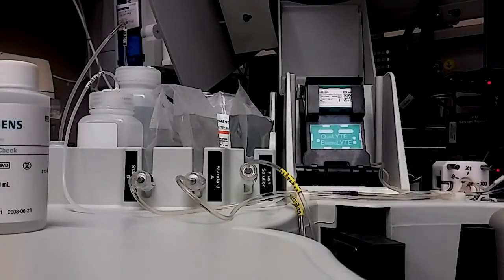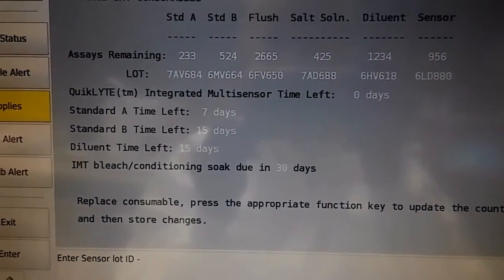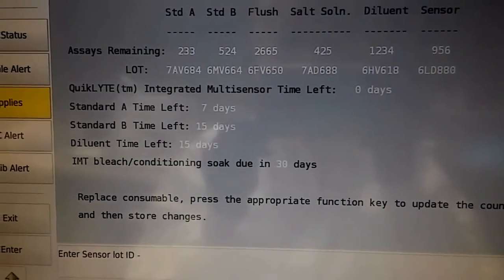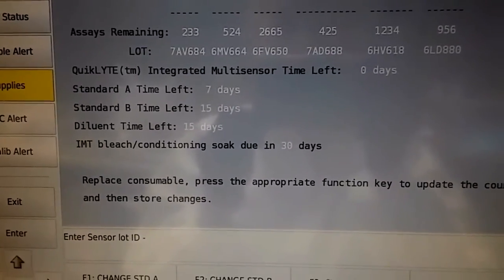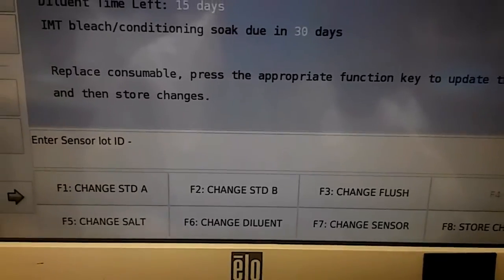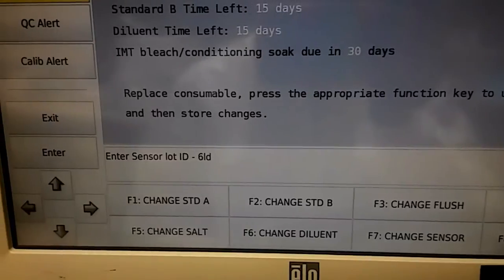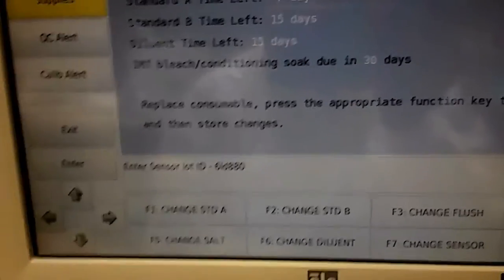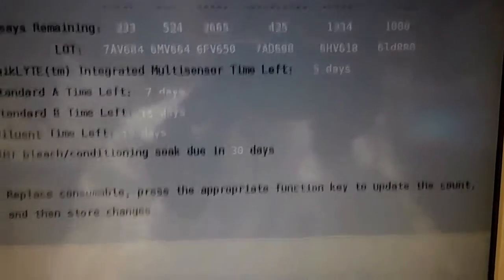So you'll go to your screen and here's what ours looks like. As you can see, the QuikLYTE sensor is due to be changed, and I just did the IMT bleach and conditioning soak which is due once a month. So first we're going to enter the sensor number — that's 6LD880 — and then press Enter, and then it shows it's been changed.